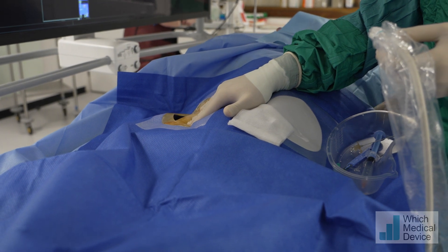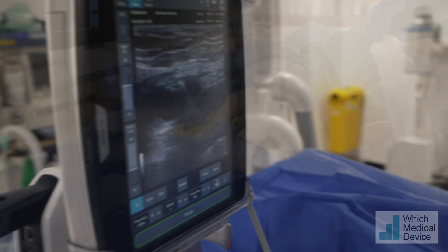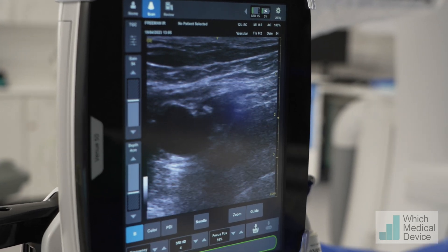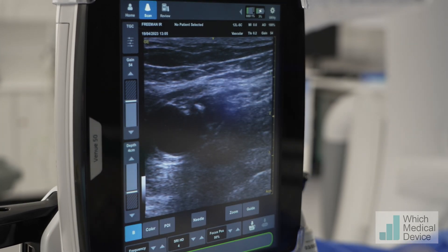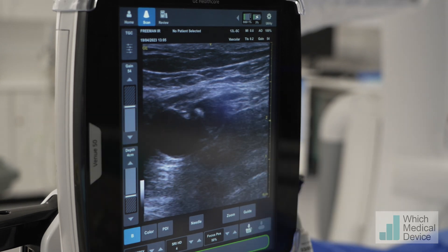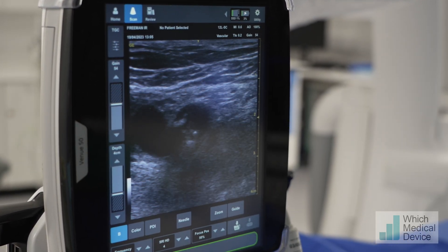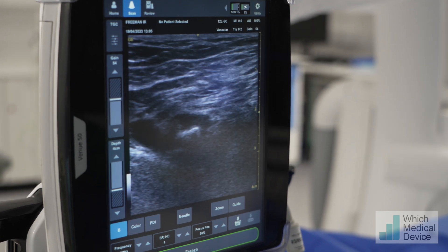Just having a feel for the pulse to make sure the pulse is palpable. Now I'm looking at the artery in the groin - the common femoral artery - which is this pulsating blob here. There's a level of calcium on its medial side, and as I'm coming down I'm looking for the bifurcation.